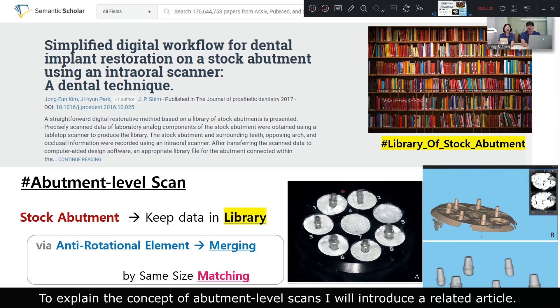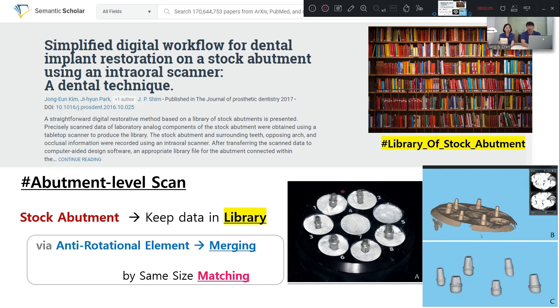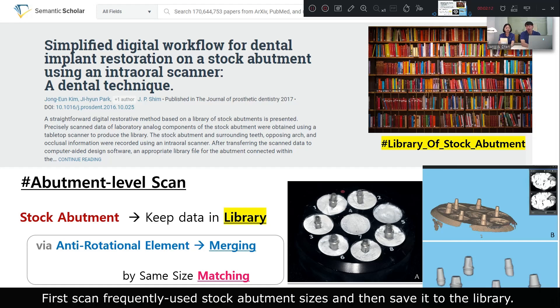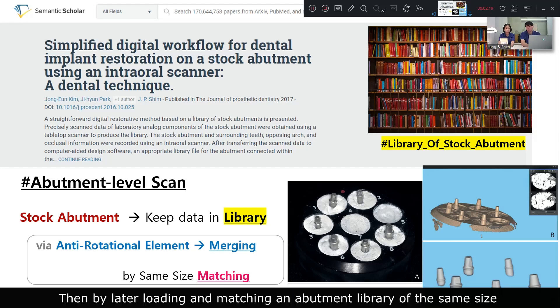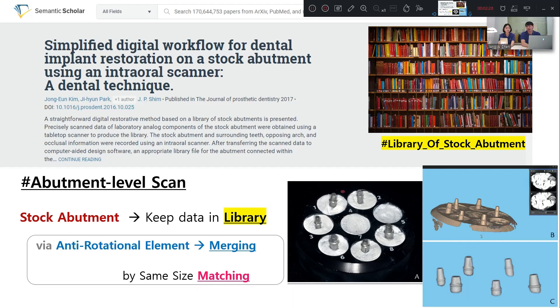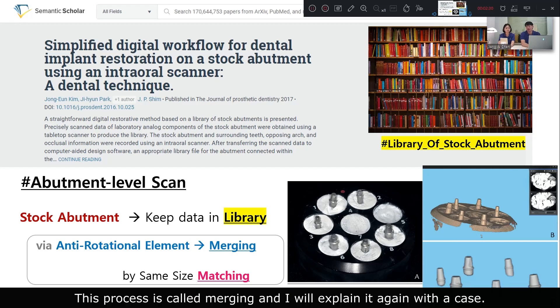To explain the concept of abutment-level scan, I will introduce a related article. I have briefly summarized the mechanism with some keywords. First, scan frequently used stock abutment sizes and save them to the library. Then, by loading and matching an abutment library of the same size, the entire shape can be restored even if only part of it was scanned. This process is called merging, and I will explain it again with a case.